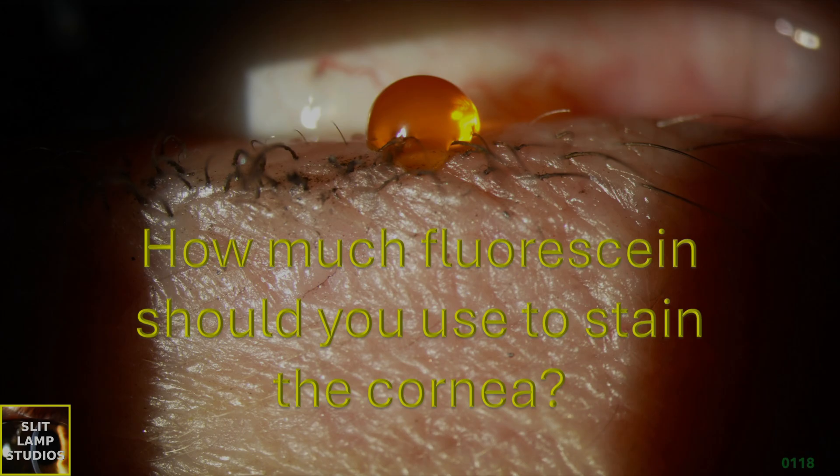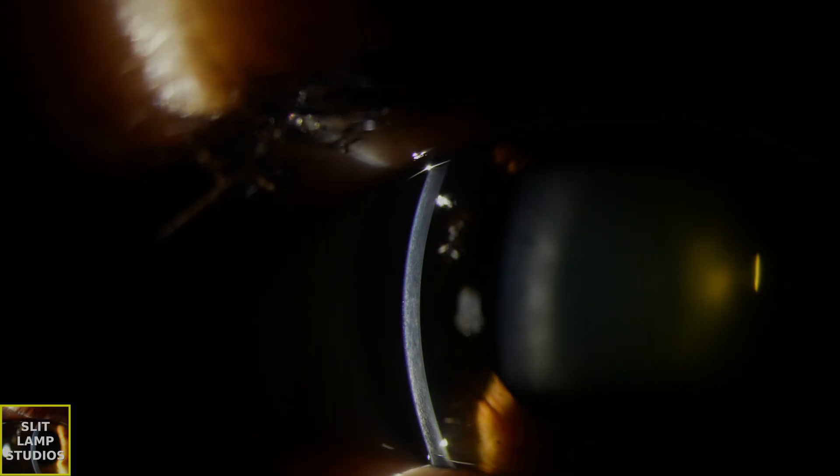How much fluorescein should you use to stain the cornea? Here's a fun little case with some pearls for your clinical examination.